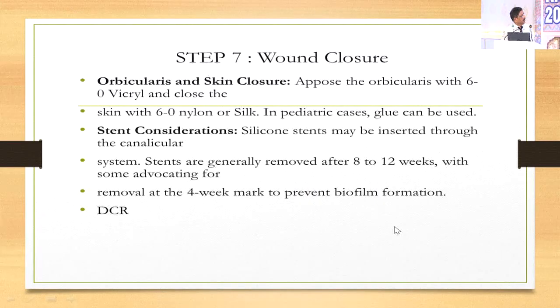And then this would be done with absorbable synthetic suture like Vicryl, and then orbicularis muscle is also stitched in another layer, and then skin is stitched. The nasal mucosa you can leave, and nasal packing you can leave and remove it next day.